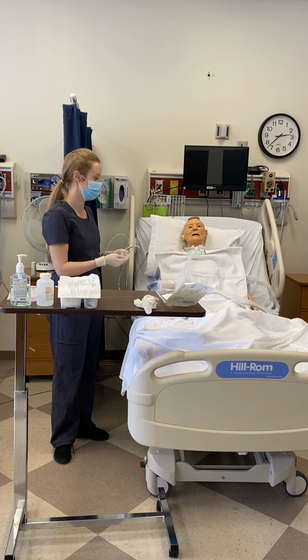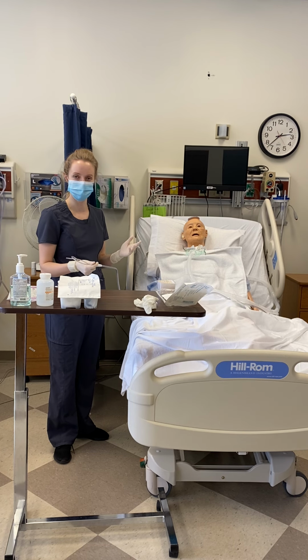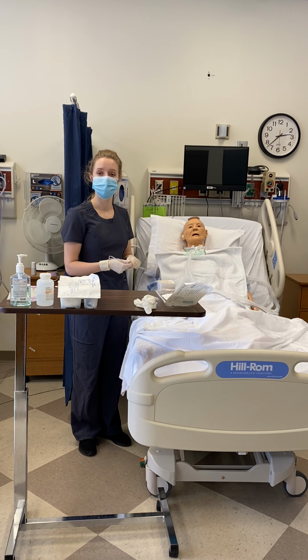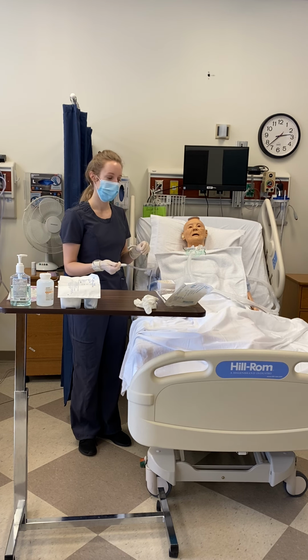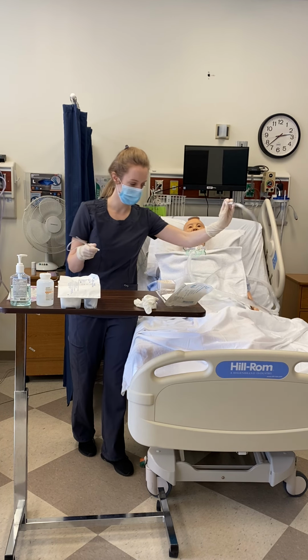Once Mr. Smith is oxygenated enough, I will turn his oxygen down to the pre-oxygenation levels and perform an assessment on him, see how he's doing, what his oxygen saturations and breath sounds are, how he tolerated the procedure. And then I want to document all of my assessments before and after, and then the amount, color, consistency, and odor of any secretions I got, along with how Mr. Smith tolerated the procedure. I want to make sure there's equipment for the next nurse at the bedside.